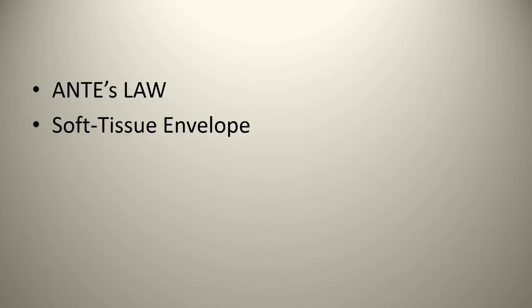And so you need to take into consideration the soft tissue envelope that's going to heal around this, and what the emergence profile is going to look like for the tooth. The only reason we mention this is because many times when patients come back after having a molar taken out and an implant placed, they'll state that there's a lot of food that can potentially get stuck in and around the actual implant crown.